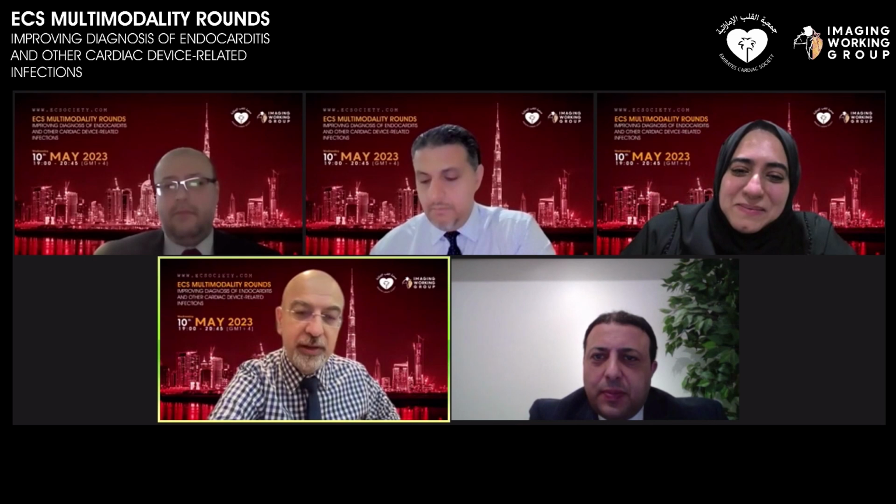Khalil's presentation, he said, yes, so you do the transthoracic, you do the TEE, you do the second TEE, but don't really go to the third TEE, because by that time you really did everything you can, and the likelihood that you're going to catch something on the third TEE is very, very low. That's correct. Thank you, Dr. Juwaria.